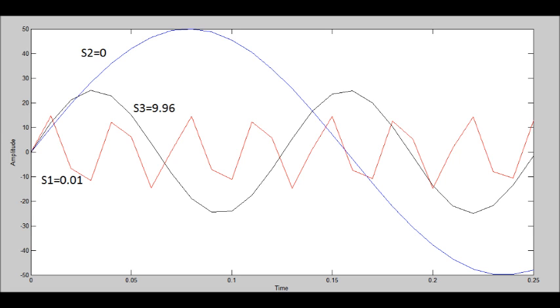We have a metric that we've made called the seizure detection metric, or S. And what that does, the larger that number is, the more likely there's going to be a seizure, or the more likely you detected a seizure. And if you detect a seizure, that means S is greater than a value D that's determined beforehand.